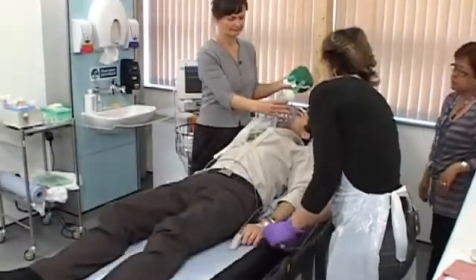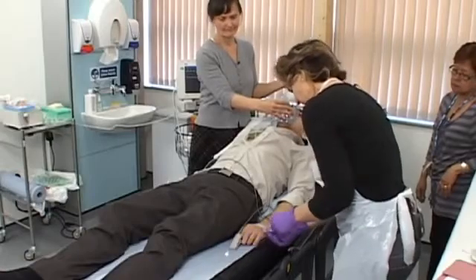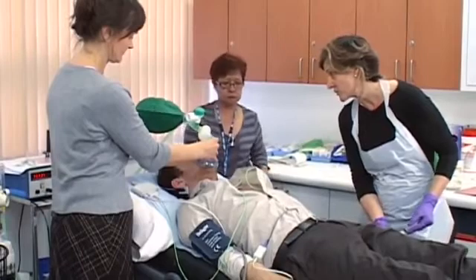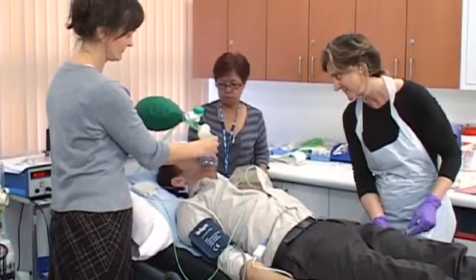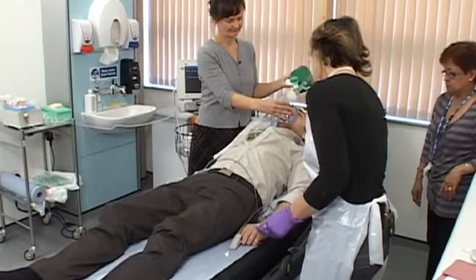The patient is then given 2 injections. The first injection is a general anaesthetic. Serious physical complications from ECT are rare. The mortality rates for ECT are low, 1 in 50,000. This is comparable to risks of general anaesthetic for minor surgery.